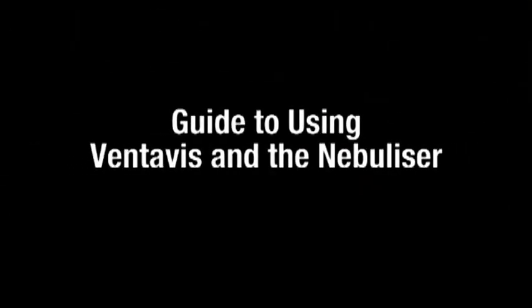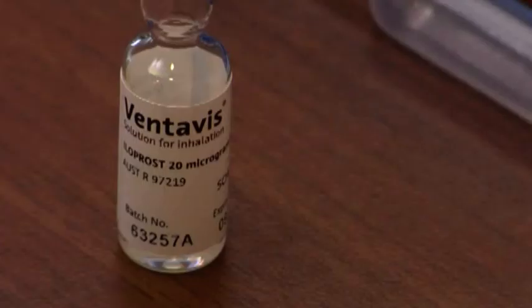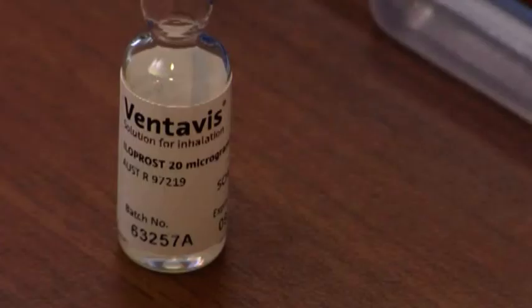This video will provide you with a step-by-step guide to using Ventavis and the nebulizer Omron U22 MicroAir. Each Ventavis ampoule contains 2 ml of solution that provides enough drug for one inhalation session. A pack contains 30 ampoules. Your doctor will advise you on the number of inhalation sessions you need per day.